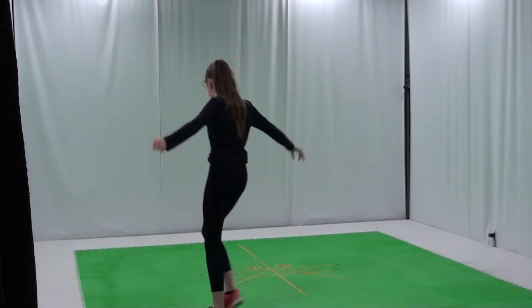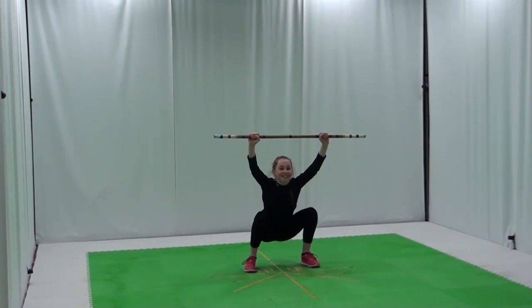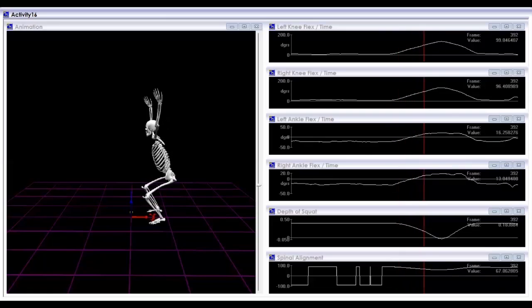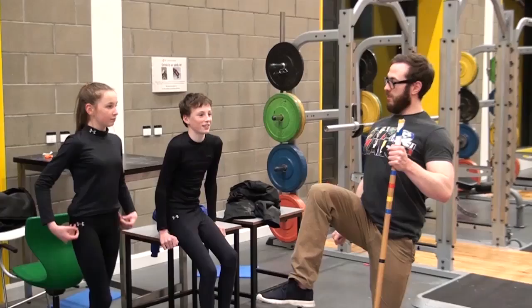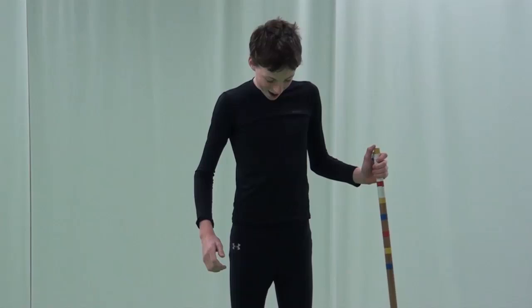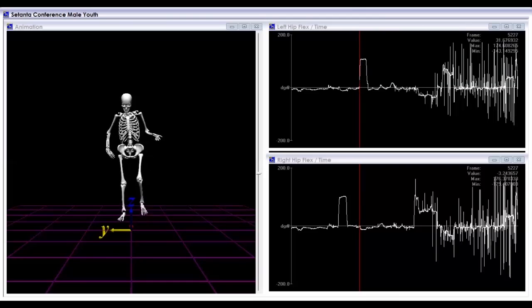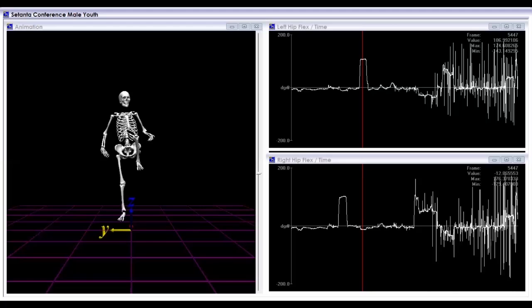A child can be screened here because there are no markers and it's free motion. They will move and you assess them, and it's convenient and easy. In fact, this would be such a useful tool in tracking the development of an athlete and individual sports participants of any age. And the great benefit is that you can compare what that individual is capable of when they were 8 up to when they were 18, 28, 38. So in terms of long-term usage, this is huge potential.